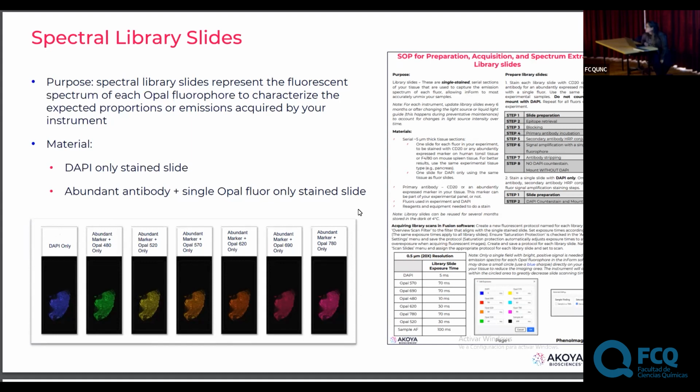Tiene anticuerpos primarios y después secundarios. Mismo B220, le ponen después el secundario y el opal que precipita va a ser de distintos colores. Pero te hace falta un solo anticuerpo. Si no, vas a tener que comprar un anticuerpo con cada color como en citometría, sino que usas el primario y el secundario.